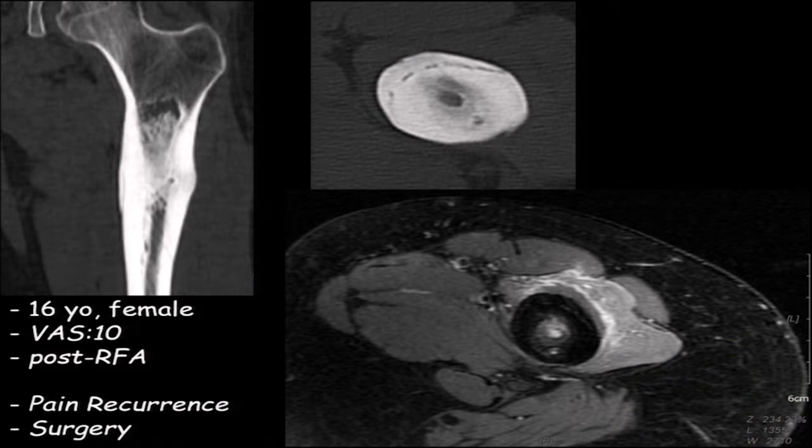It was one of the first patients, and we tried to treat it in a different way, by treating the periosteum denervation. And it didn't work. She eventually went through surgery, but we learned from that that the only way to treat the osteoid is to directly ablate the nidus itself.